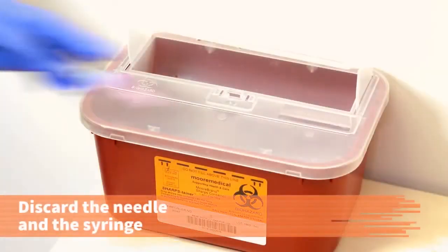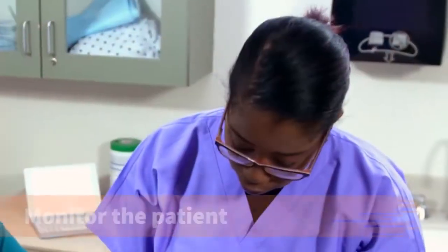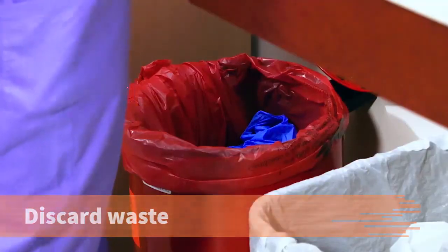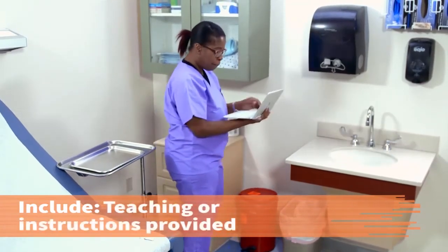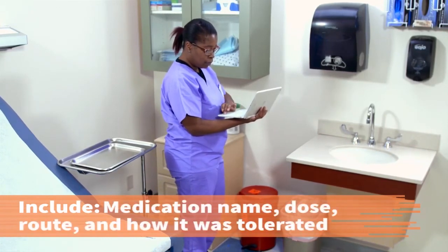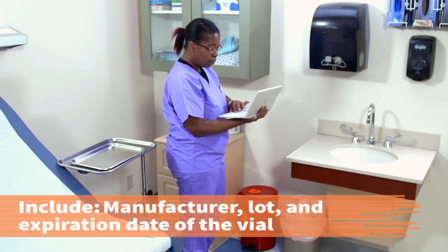Discard the needle and syringe in a biohazard sharps container. Make sure to put the needle in first. Observe the patient for any adverse reactions. Clean up the area. Discard all waste, including your gloves, in the biohazard waste container. Sanitize your hands. Document the procedure in the health record. Include assessments done, patient allergies, teaching or instructions provided, the provider ordering the medication name, dose, route, and how the patient tolerated the medication. Also include the manufacturer, lot, and expiration date for vaccines.